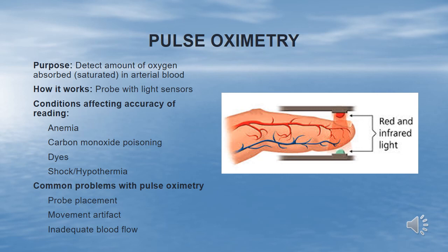Circumstances which impede pulsation or blood flow can interfere with the reading. Pulse oximeter probes should be placed on the opposite extremity from the blood pressure cuff or tourniquet. If the finger is placed too far into a clip-style probe, venous pulsation can occur, which mimics arterial pulsation and will produce inaccurate results. Remember that SpO2 measurement alone is not enough to evaluate the status of all patients.